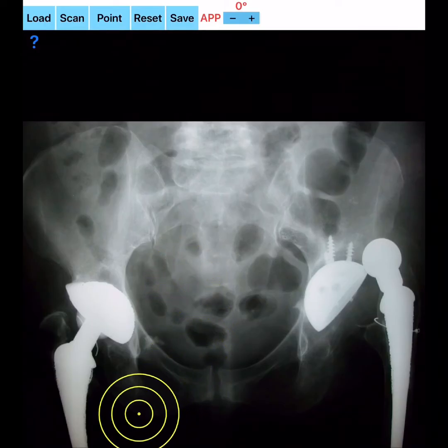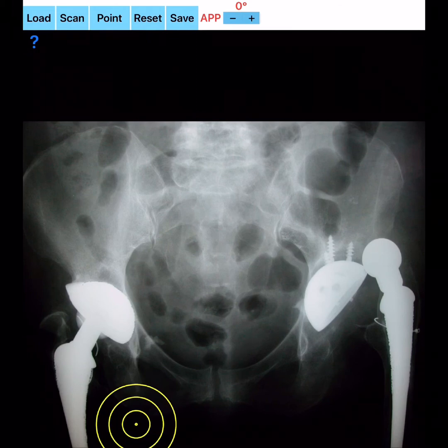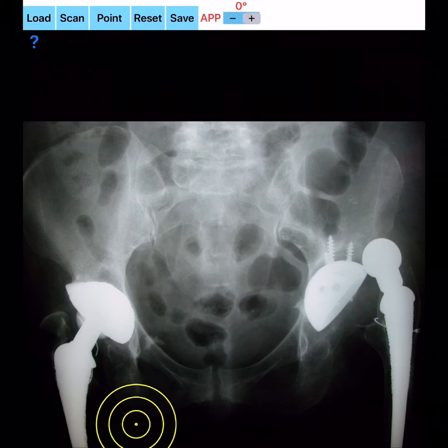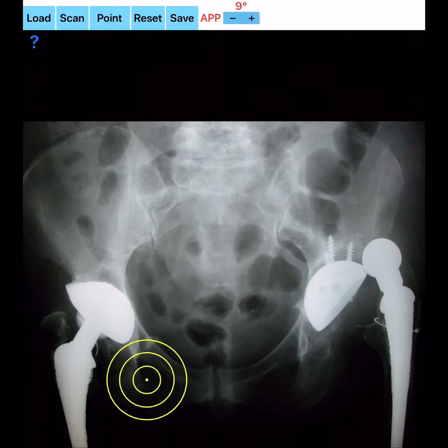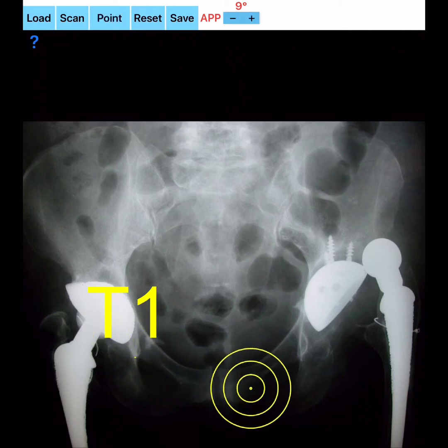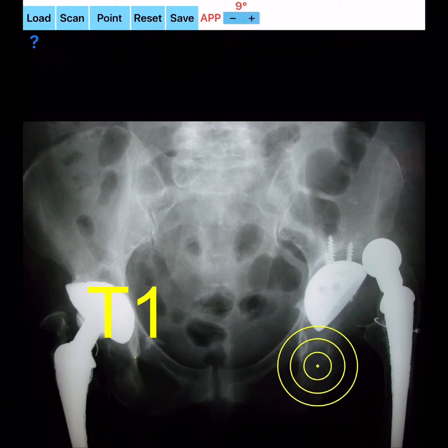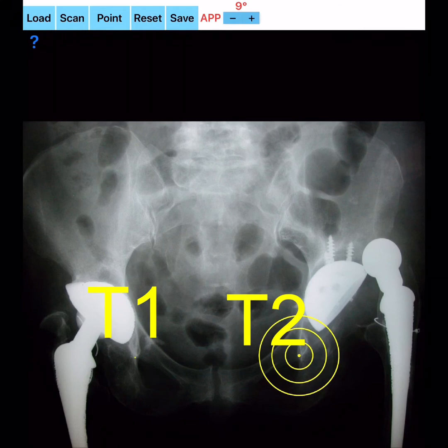By moving the transparent circular yellow template over the teardrop and by clicking the point button, the teardrop of the selected side is marked as T1 point. The order of selection — right-left or left-right — does not influence the results of measurement. Next, by clicking over the other side's teardrop, T2 point is marked and the yellow inter-teardrop line T1–T2 is drawn.